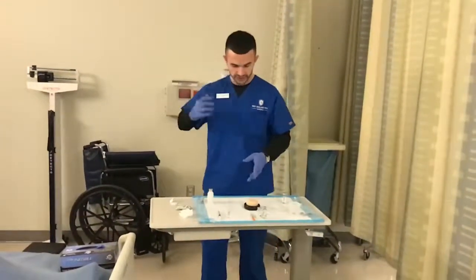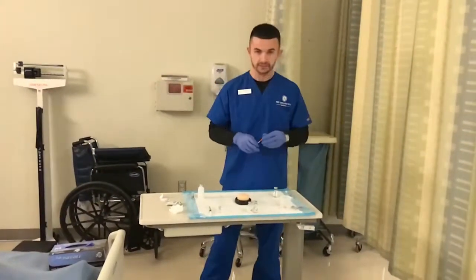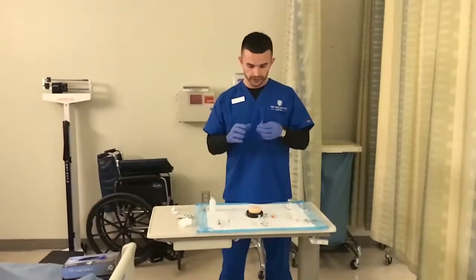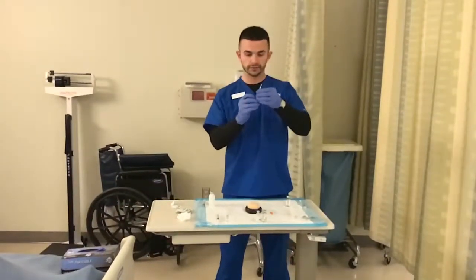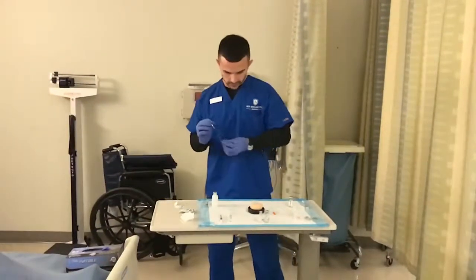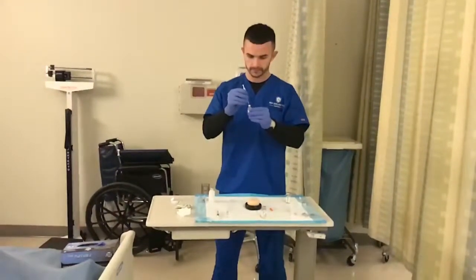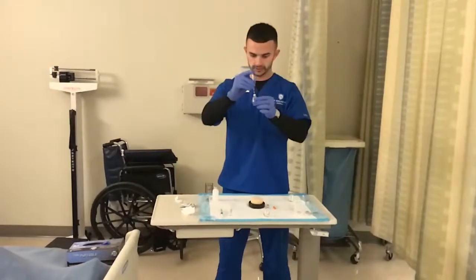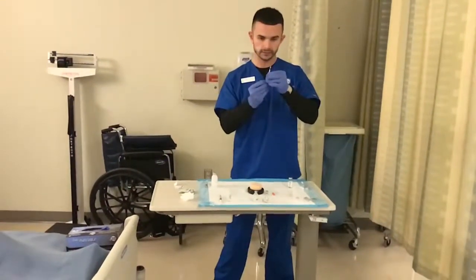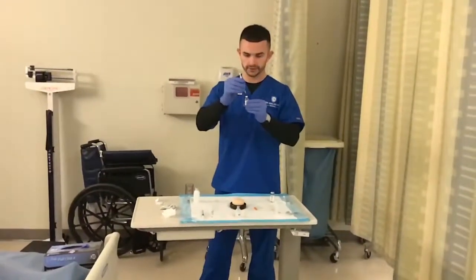So next, I will be doing subcutaneous insulin. So with insulin, you have regular insulin and NPH insulin. So again, to start, we'll say we're doing 5 units of each. So I would first draw up 5 units of air. And I'm going to first put air into my NPH insulin. Check that. I'm going to pull back, and again, another 5 units. And I'm going to inject this 5 units of air into my regular insulin.